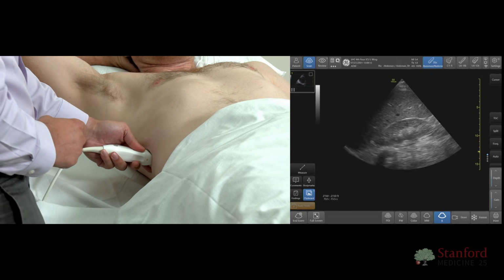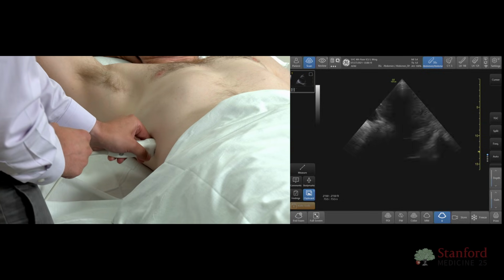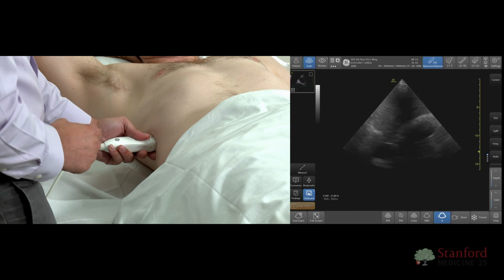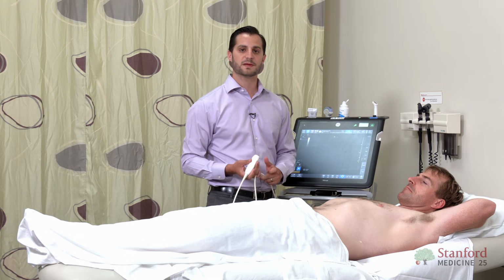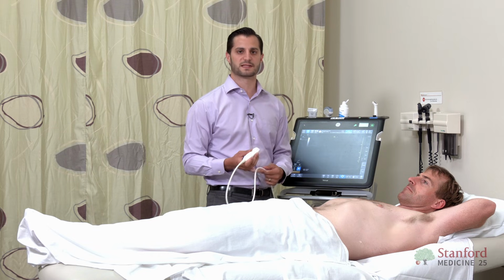You can also obtain a cross-sectional view of the kidney by rotating the probe 90 degrees and scanning from a superior to inferior fashion. You can use this to measure the length and width of the kidney. Let's go ahead and scan the left kidney. Keep in mind that the right kidney is lower in the abdominal cavity than the left kidney, so you may have to go up one or two rib spaces when scanning.